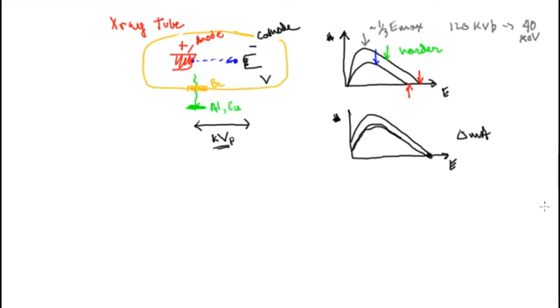One simplification, and something I didn't mention, is that oftentimes these tubes will actually show lines. These are the K and L shell transitions, and M also, from the material in the anode. That means you're getting characteristic X-rays out of the anode itself, and you can see those in the spectrum of the tube.